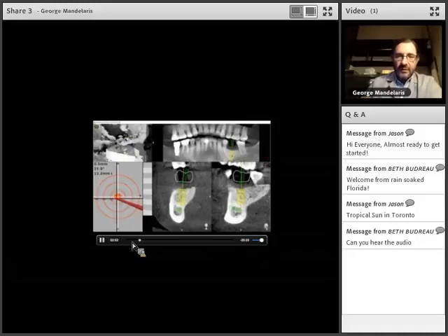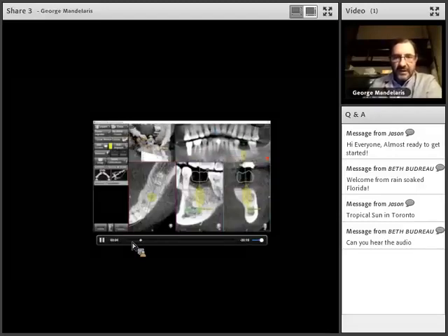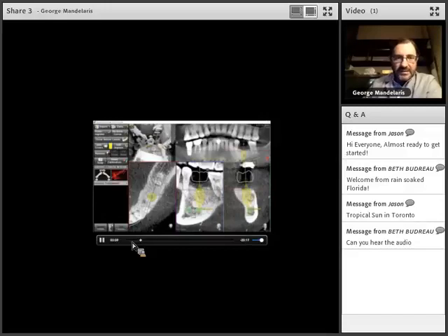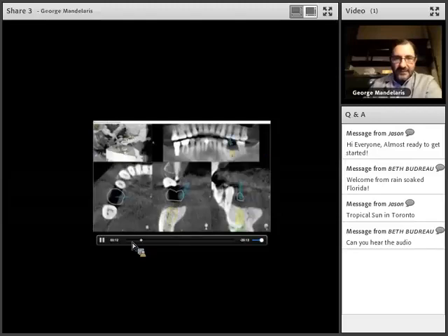That seems to be accurate, and now we're going ahead and trying to get the entry point. I will tell you that there is no better marksman, there is no better sniper in the world than Luigi Stefanelli. He is 100% the best. This is not as simple as it seems, although he makes it look that way.